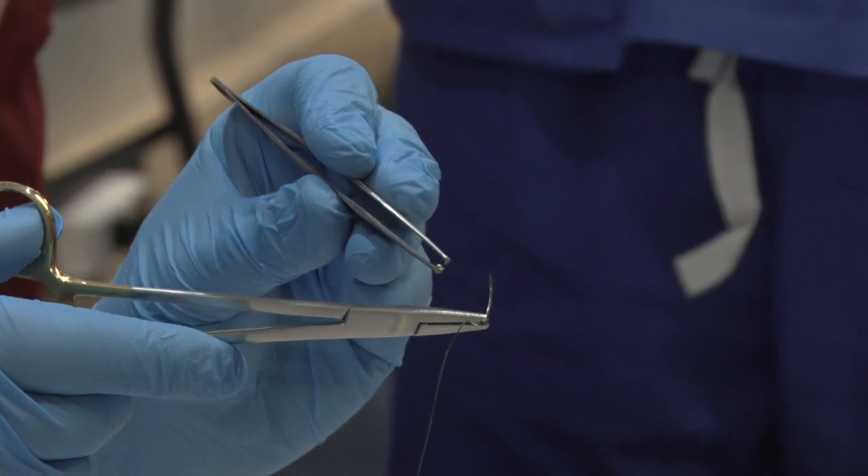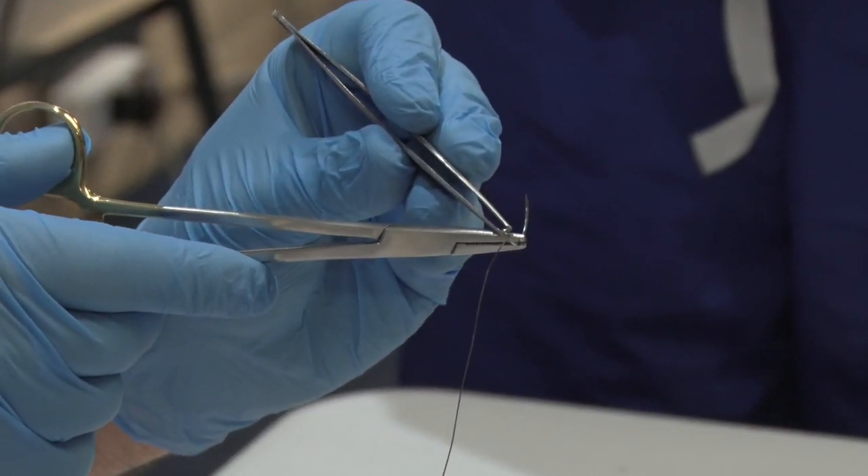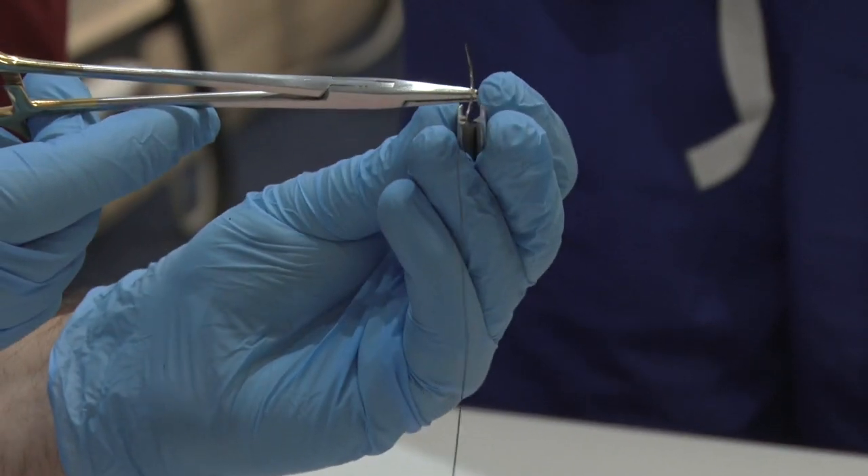Understanding the suturing instrumentation and handling these instruments with ease is important. The instructor demonstrates the instruments and the students follow.